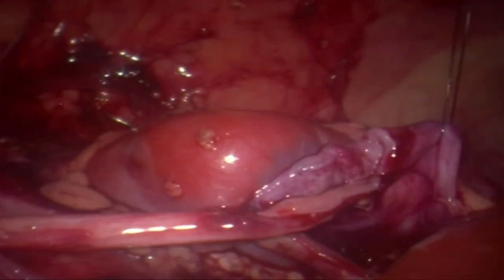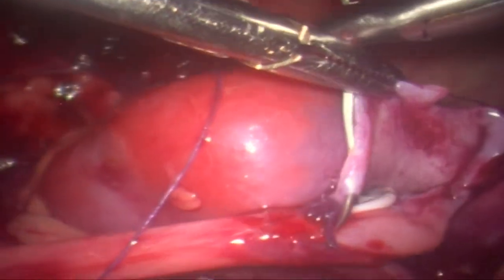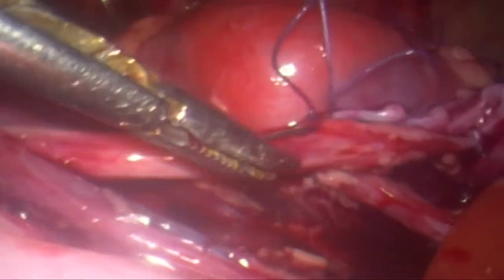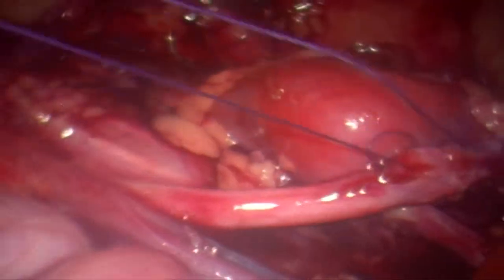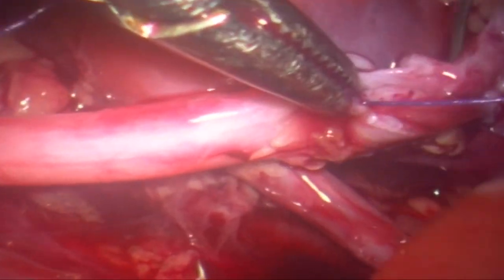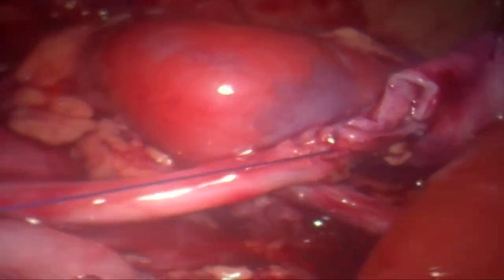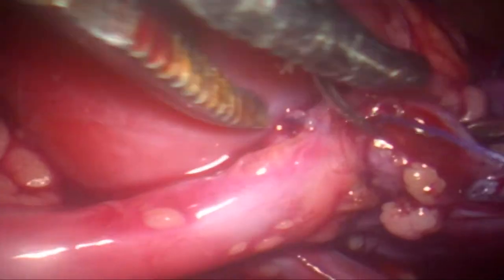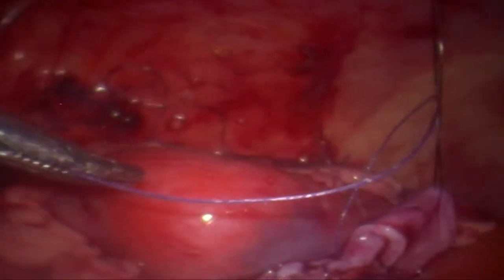Once this is done, the second stay suture is removed, and now we are continuing with the anterior layer. This is also a continuous 5-0 vicryl running suture, and this is slightly easier because we are doing it from the outside. That is the continuous 5-0 vicryl suture completing the anterior layer of the anastomosis. Once we reach the top, we tighten the knot and then complete the partial rent in the pelvis. That completes the pyeloplasty.